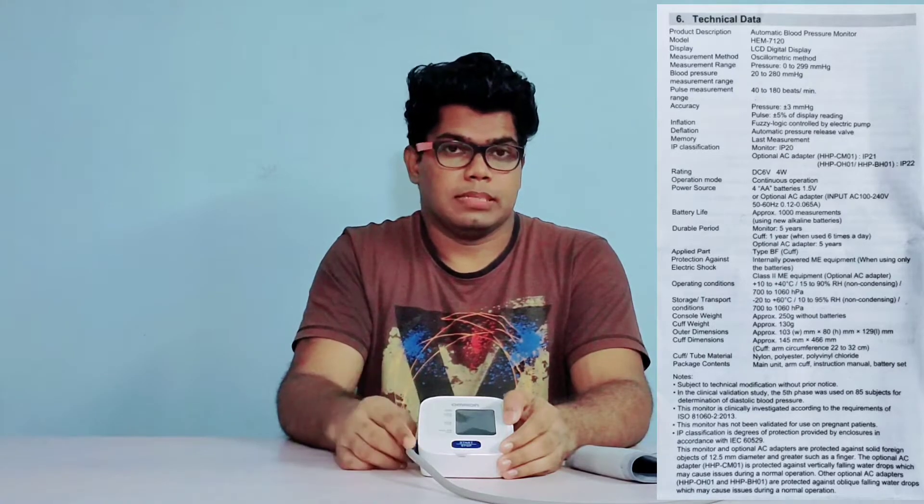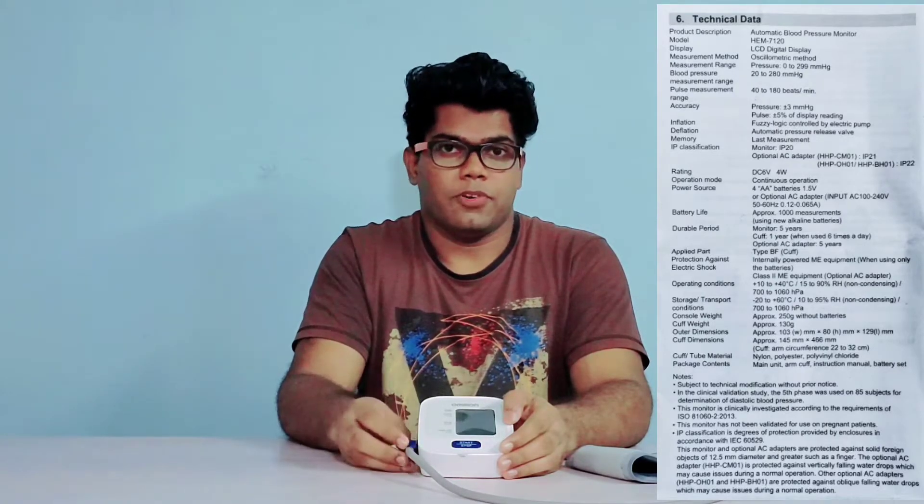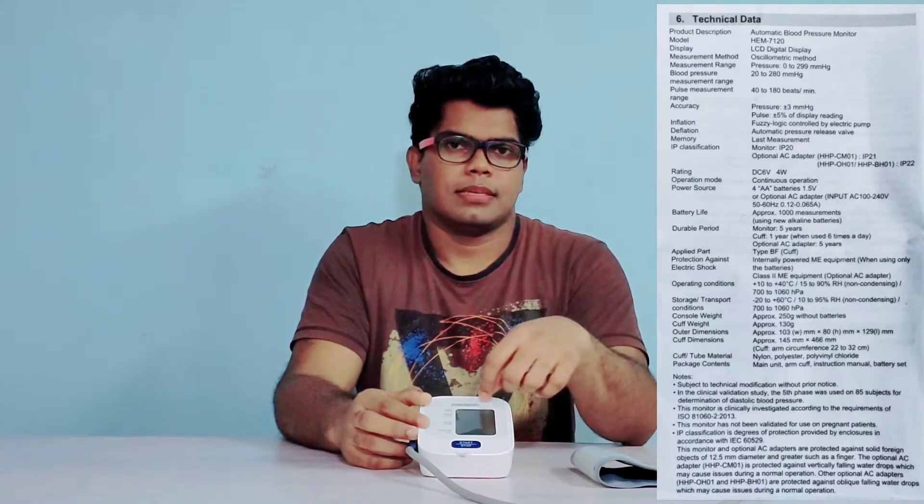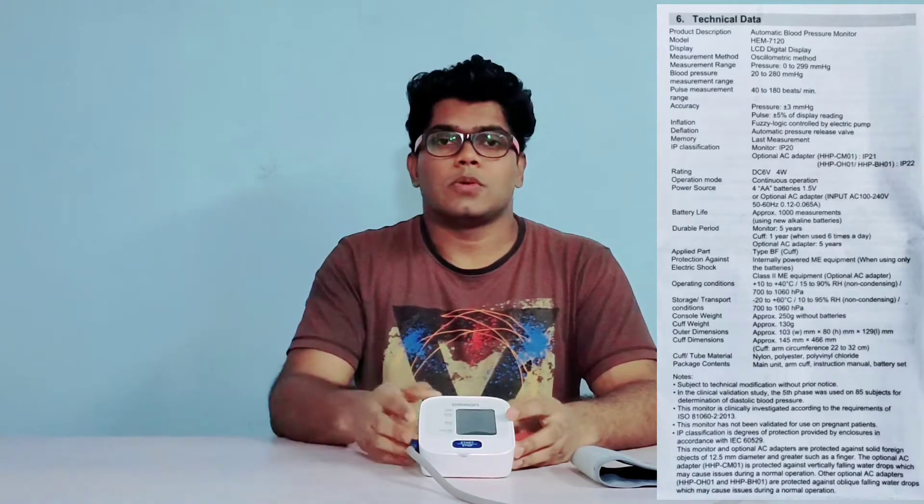The BP monitor has a design life of 5 years and the arm cuff of 1 year when used 6 times a day. Other specifications you can read on the screen — please pause the video and understand. This product has not been validated to be used on pregnant patients.